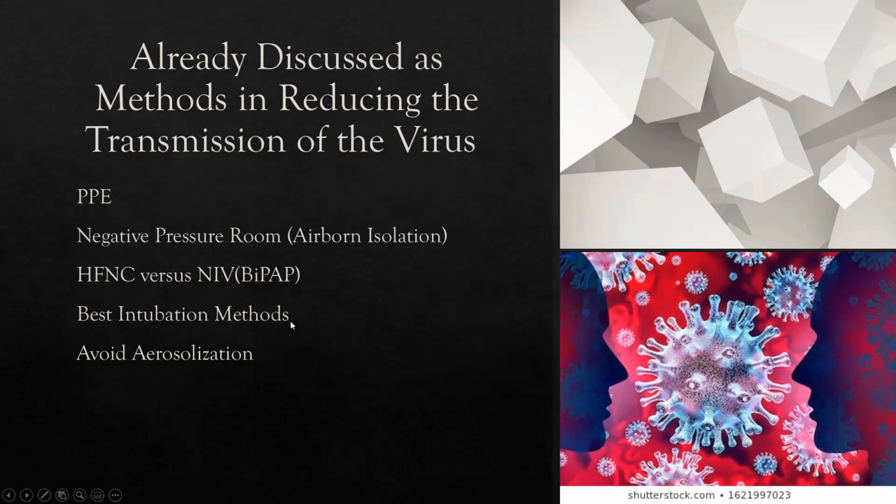And then for intubation, the best intubation methods, how can you reduce exposure to the virus during an intubation? Would direct laryngoscopy be good, or what about using the glide scope? You vote for the glide scope? Yeah, do you know why?